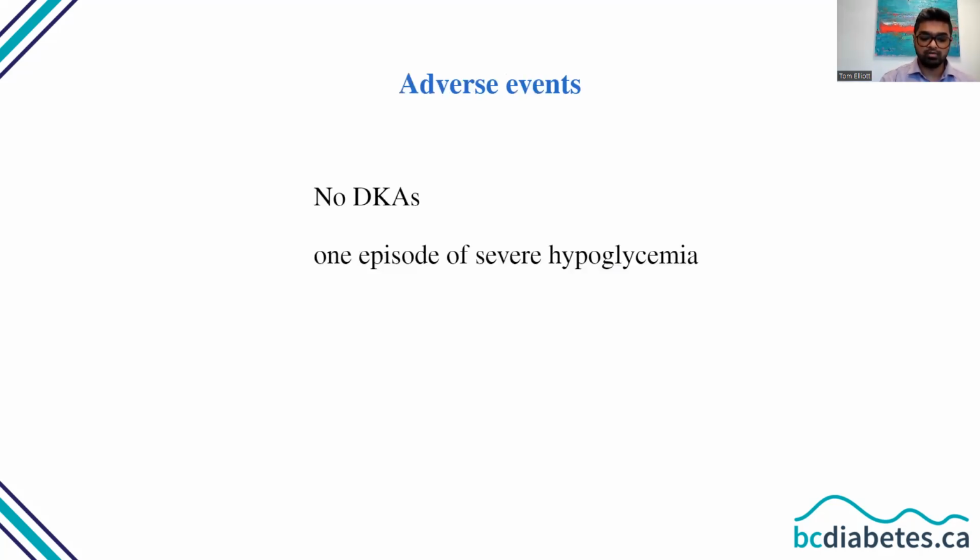There have been no reported episodes of diabetic ketoacidosis. When I first prepared these slides, no episode of severe hypoglycemia had been reported. However, 3 weeks ago, we had our first hypoglycemic seizure.